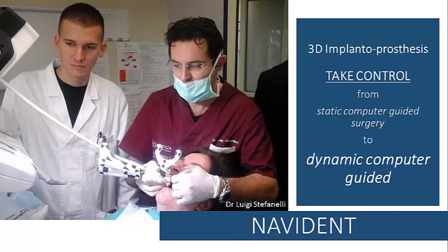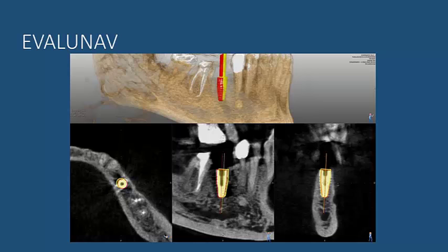In this video we present EvaluNav. EvaluNav belongs to Navident and is a software which allows us to compare what has been executed versus what has been planned, and therefore it quantifies the gap between the two events.